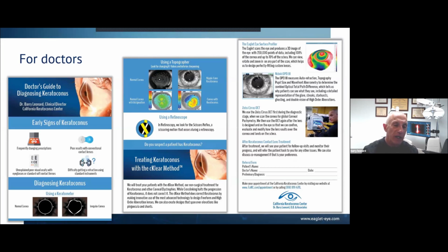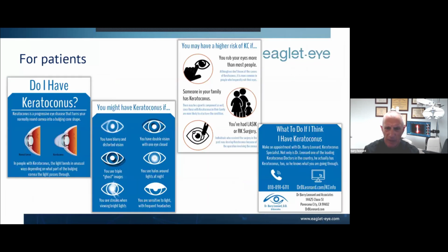So I'm educating those doctors to at least recognize the signs of keratoconus, because we screen every person on a topographer that comes in our office, but a lot of people don't screen them or don't even have one. As we know, there are scissor reflexes or prescriptions changing often, and other signs they can look for. I've developed this as part of my marketing to other doctors, and that's that foot in the door of how we can work together and co-manage these patients.